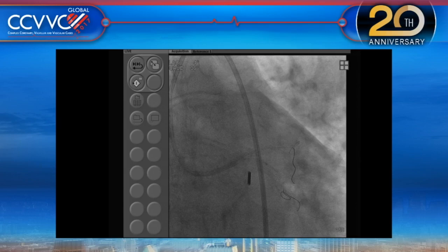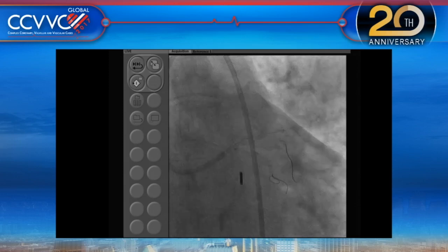I think it's important because they crush, so there are three layers there. So it's just that a bigger non-compliant balloon might not cross, and I think they are on the safe side doing that. Yeah. Cindy? I'm a little worried about crushing the circ stent because there's so much atheroma at the ostium, and so I might have crushed the LAD stent.